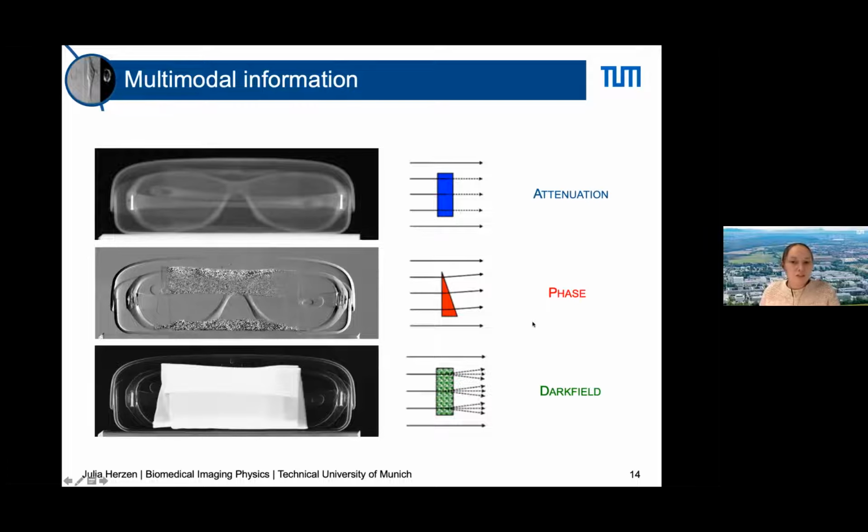If you now look at the refraction, you should see two main aspects. One aspect is that we are obviously only sensitive in one direction. What we measure is the gradient of the phase just in one direction. This means we use a 1D grating, and only perpendicular to this grating are we sensitive to this signal. We could overcome this by using a 2D grating, but this would make it even more complicated. At that time, we have some solutions for that. I will also come back to that.